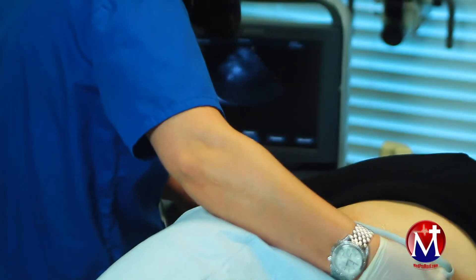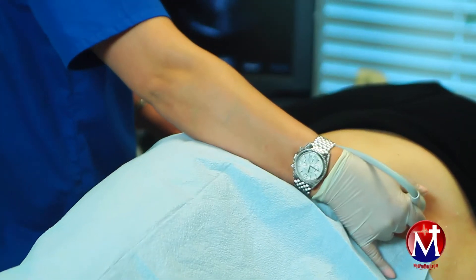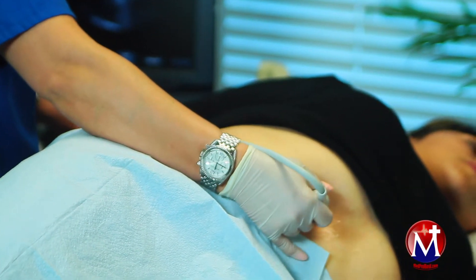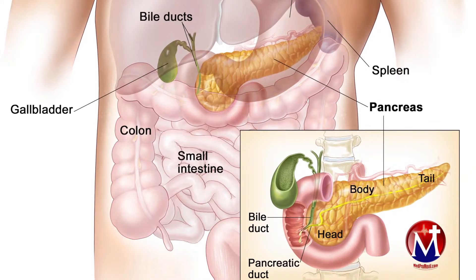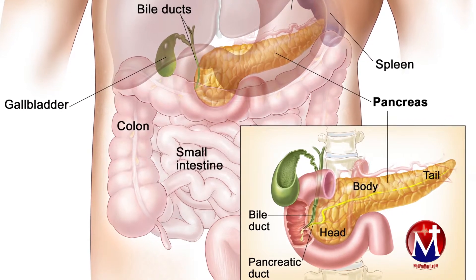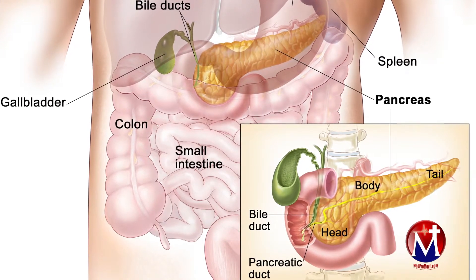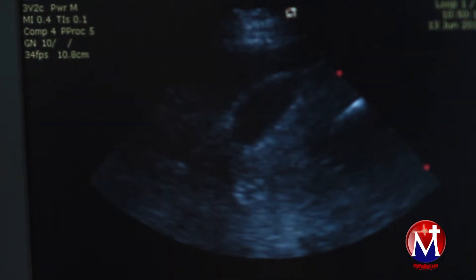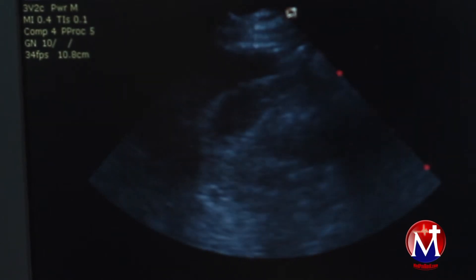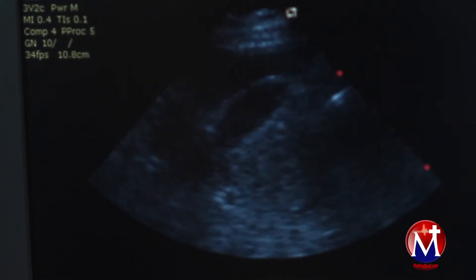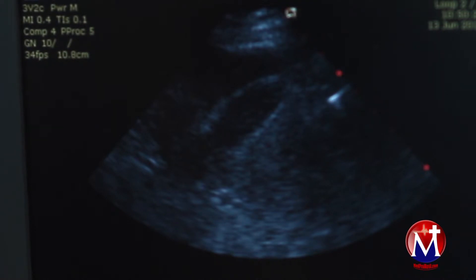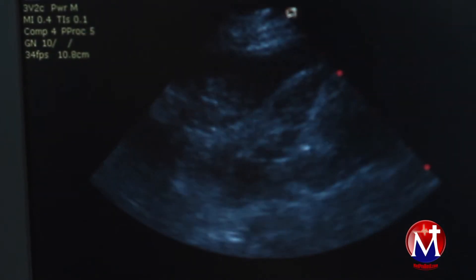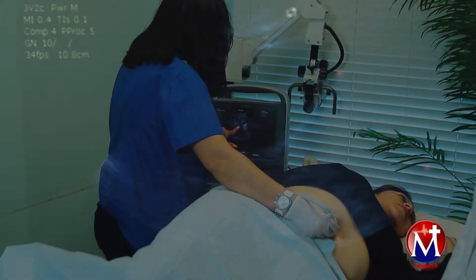With the patient turned on her left side, Layla is able to image the gallbladder. The gallbladder looks almost like a black circle, which is normal. We're looking to determine if there are any gallstones, any inflammation of the gallbladder wall, or pericholecystic fluid that could indicate gallbladder dysfunction.